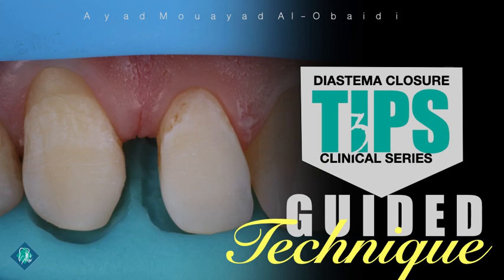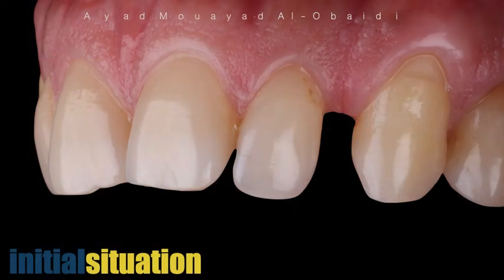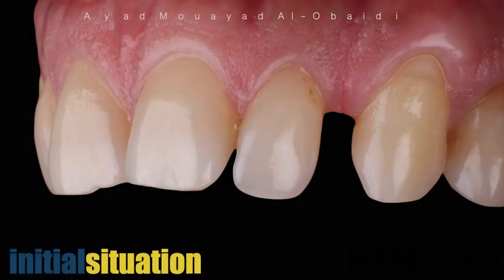Hi again, welcome to the Estimate Closure Clinical Tip Series. As per your request, today I will talk about the guided silicon index technique, and I will describe this technique using this clinical case.